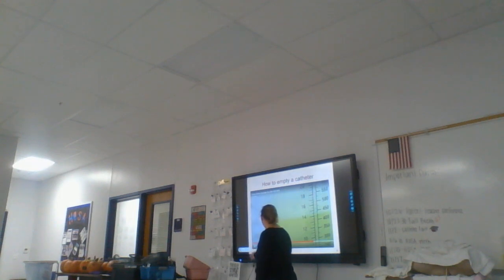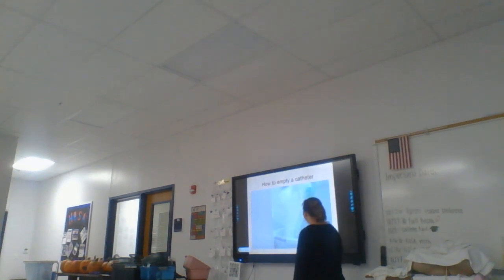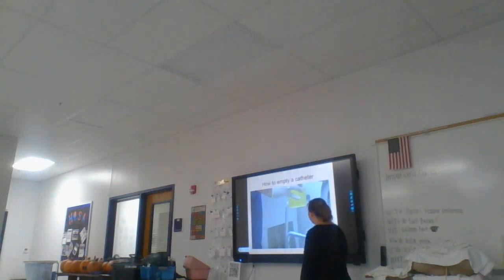You can see that the urine in this container is nearest to the mark of 425, so the amount that we will document is 425 milliliters or cc's. Once we've measured it on a barrier, on a flat surface, at eye level, we can now empty the urinary graduate container. We'll throw the barrier away, open up the toilet, and dump the contents into the toilet. Now we're going to rinse the graduate container and deposit the rinse water into the toilet as well.